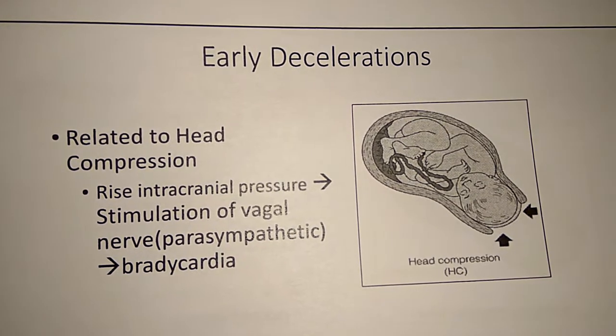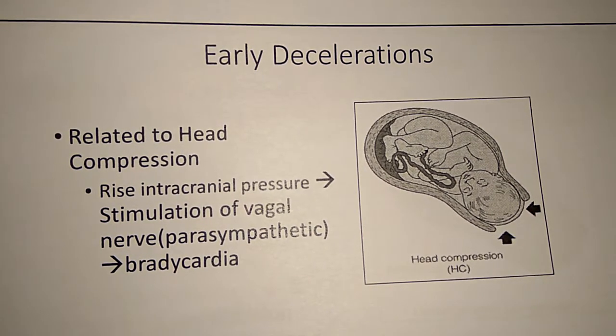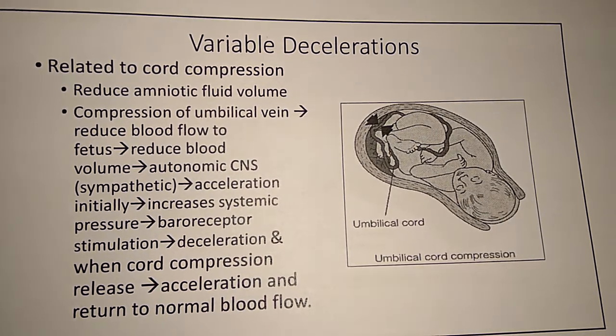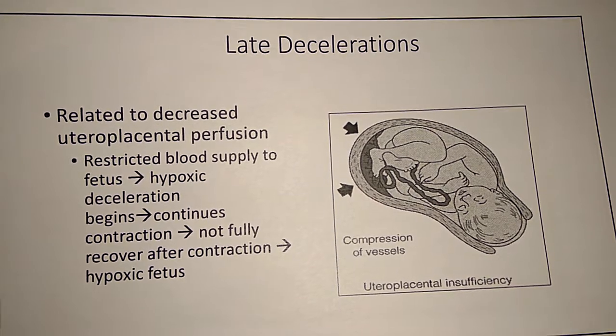So this is the pathophysiology, why deceleration happens. Early deceleration, variable decelerations, and late decelerations.